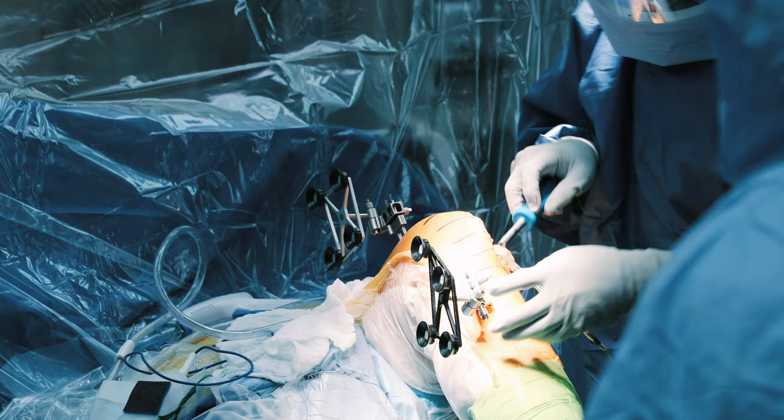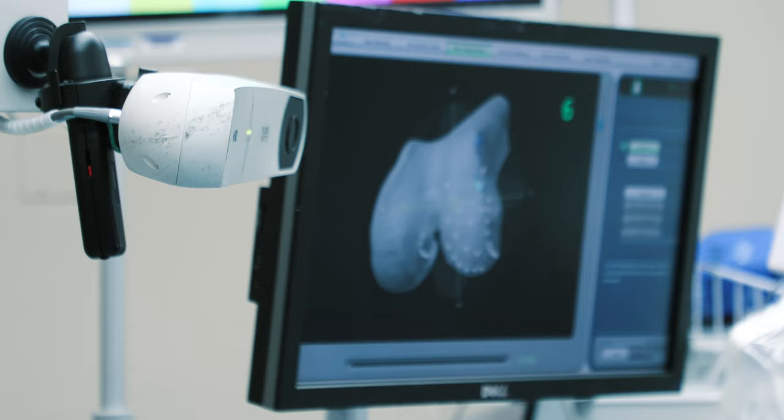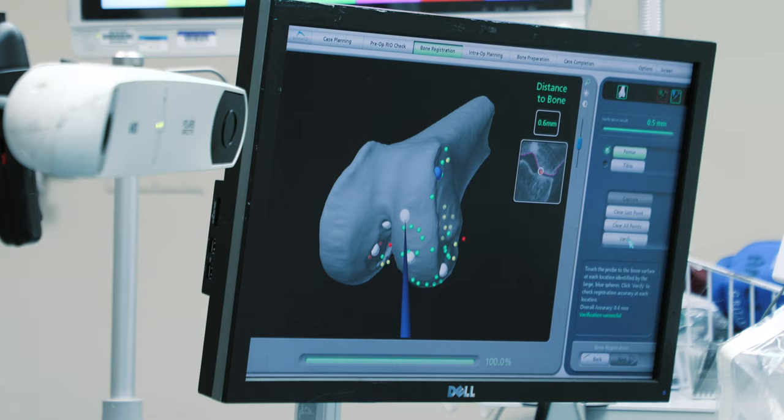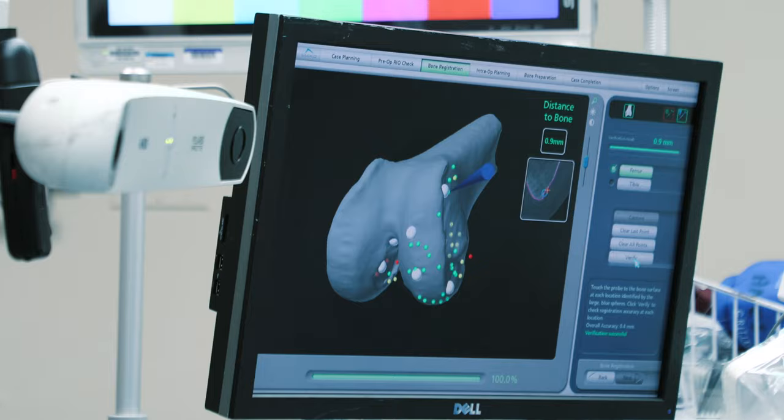The first job in the operating room is to tell the robot where your knee is in space. It doesn't really have eyes and cannot see your extremity itself. We secure little pegs with reflective balls, and the robot camera can see those reflective balls. Then you move the knee so the robot gets a sense of your range of motion and joint position.